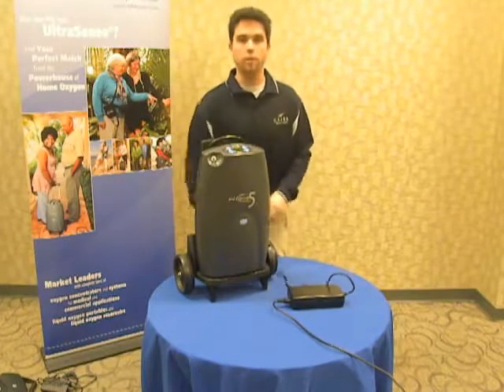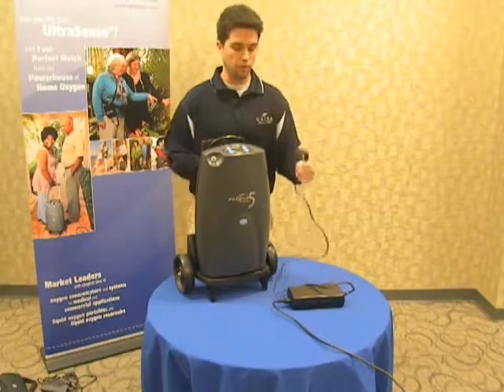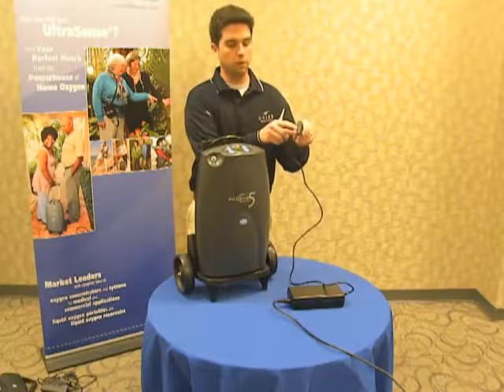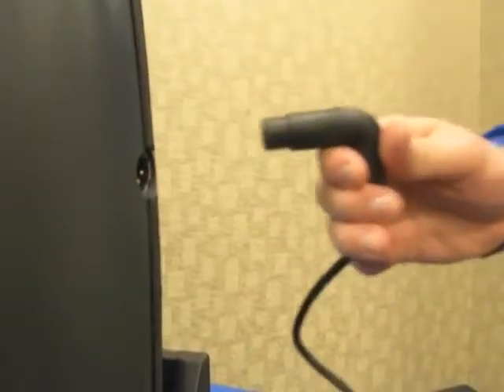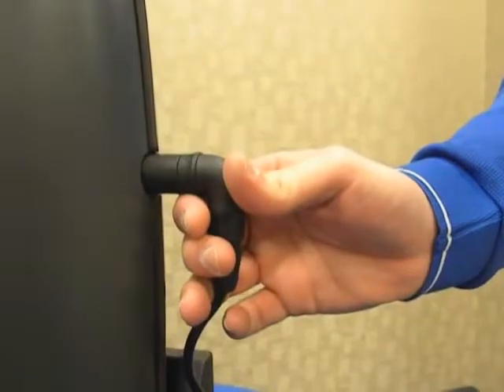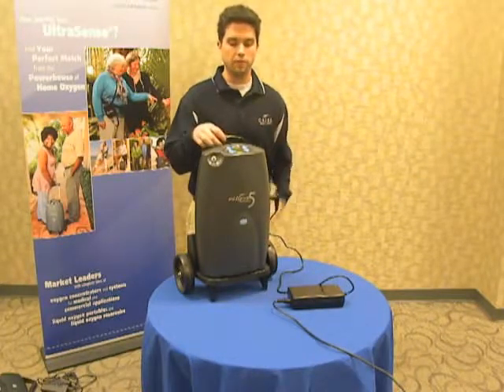Assuming that that light's lit up, you're ready to go ahead and connect your AC power supply to the Eclipse 5. It's an elbow connection here that goes in straight to the side of the Eclipse. There's an arrow on top of the elbow connector that indicates up, and you'll push it straight into the side of the Eclipse. When you do this, the Eclipse will beep, as you hear, and will light up for a brief second.